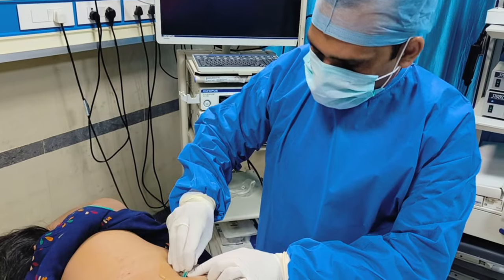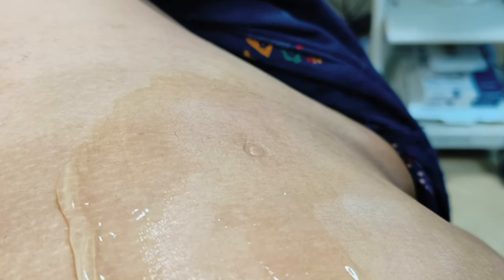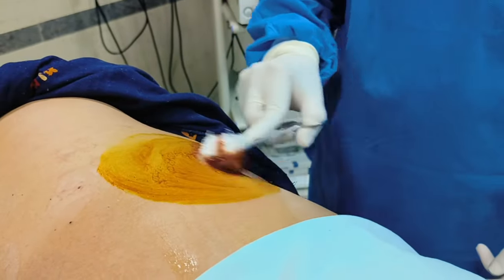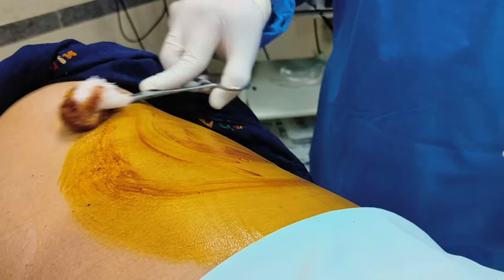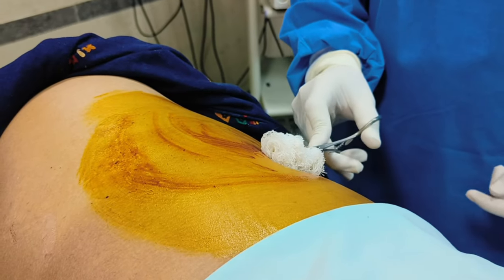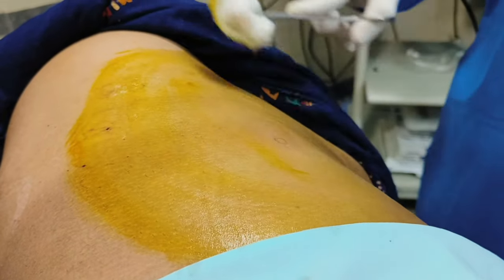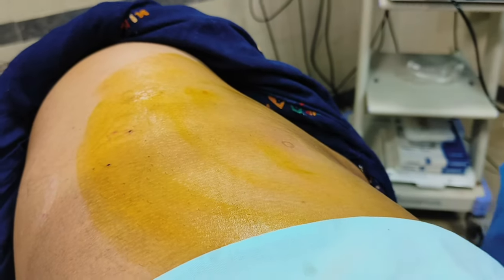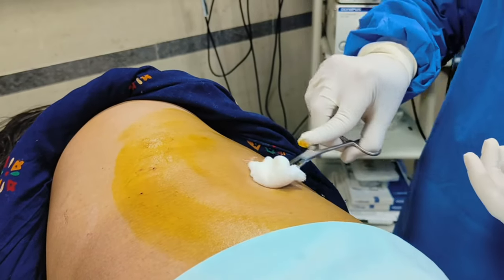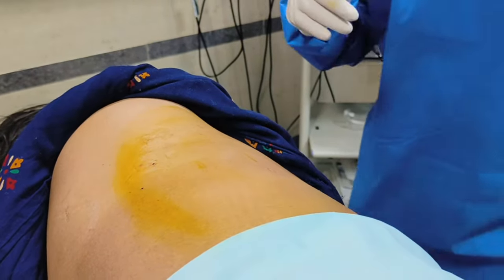This is our ideal site for pigtail insertion — we will mark it with a needle cap. Now we will sterilize this area in three phases: first with spirit, then 10% betadine, then again with spirit. We have to sterilize from the surgical site to the shoulder and downwards to the pelvis to maintain sterility, otherwise it will cause empyema and other surgical site infections. We will take a dry cotton and wipe from inward to outward to avoid contaminating the surgical site.